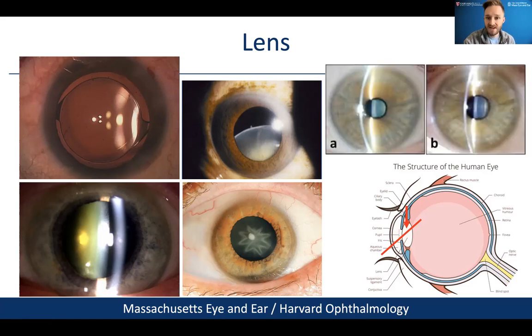Notably, most of the time when we're evaluating ourselves, our friends, or we're practicing, the eye won't be dilated. But if you look through an undilated pupil at an angle, you can still start to see the remnants of pieces of the lens, perhaps not the whole thing.